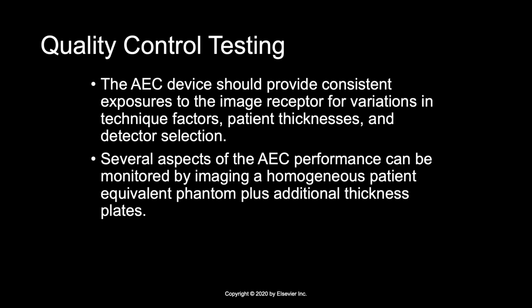The AEC device should provide consistent exposures to the IR for variations in technical factors, patient thicknesses, and detector selection. Several aspects of the AEC performance can be monitored by imaging a homogeneous patient equivalent phantom plus additional thickness plates that you can add to the phantom.